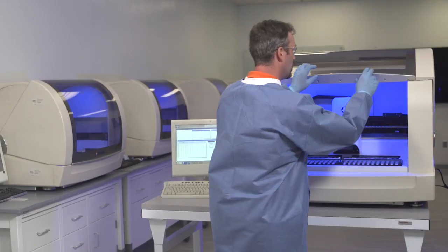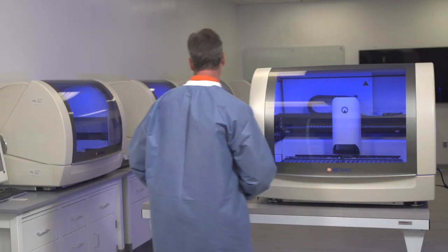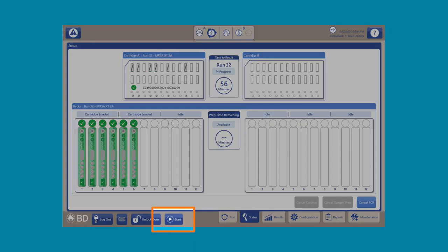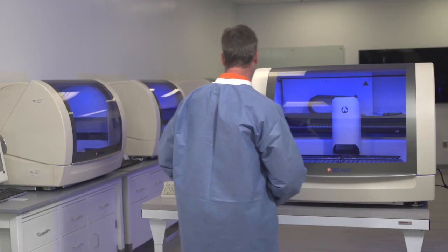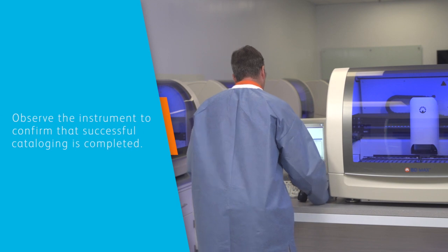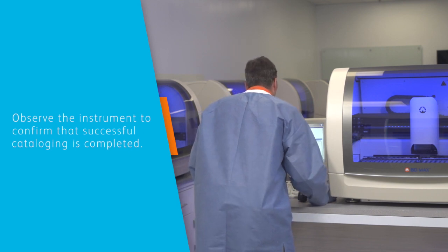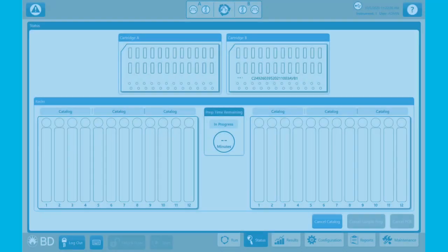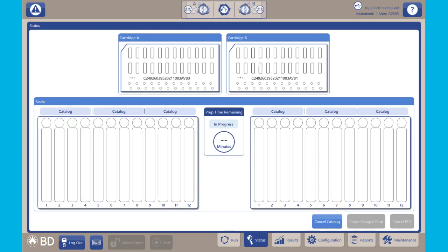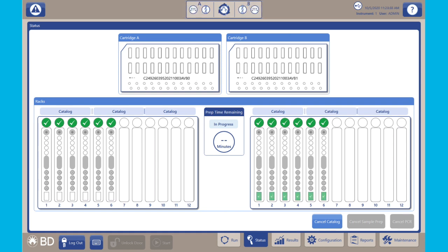Close the BDMAX System lid and click Start to begin the processing. As each item successfully passes the Catalog check, a green Passed icon appears for that consumable.